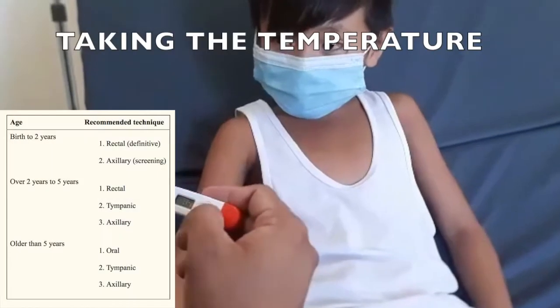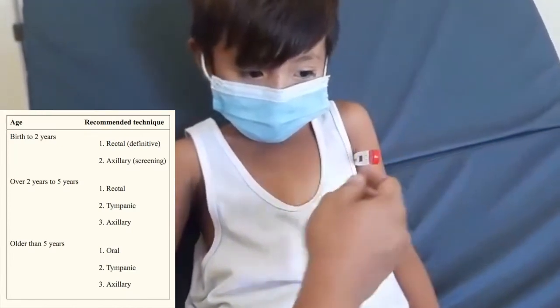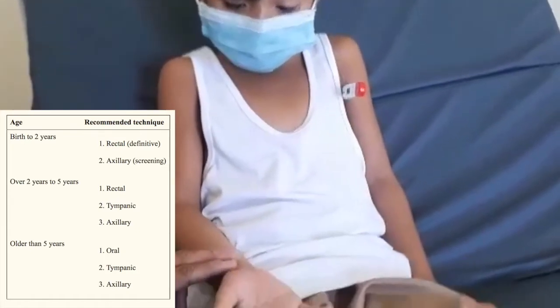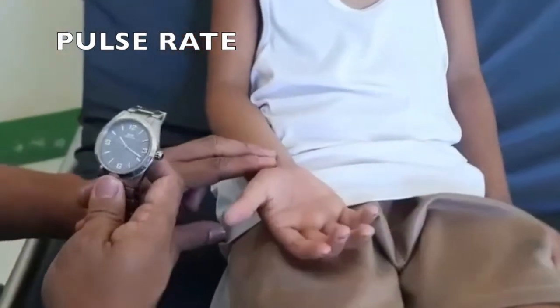In obtaining the temperature of a pediatric patient, it can be obtained through rectal, ear, oral, or axillary. The recommended technique varies with the age of the patient. While taking the temperature, we can also check for the pulse rate.